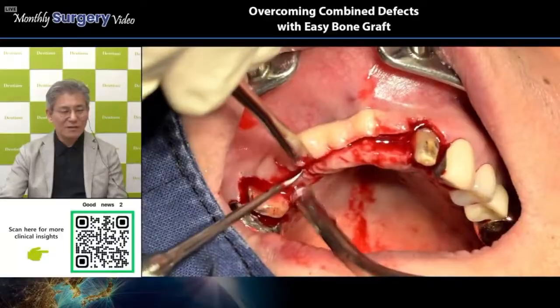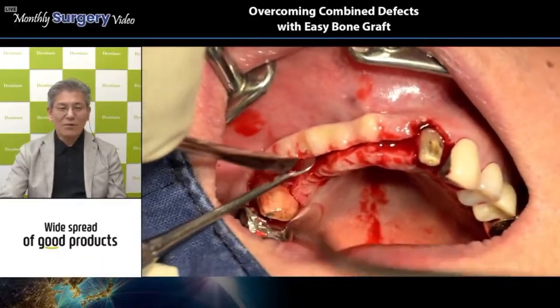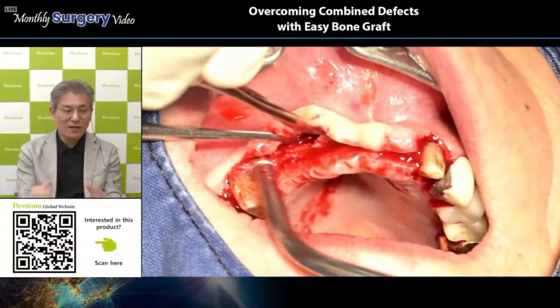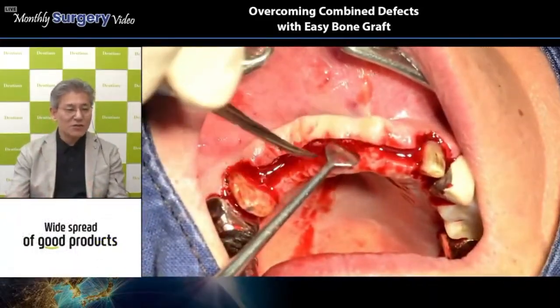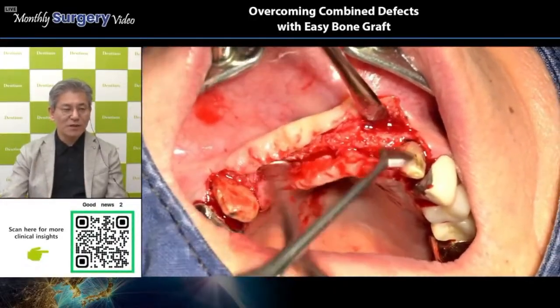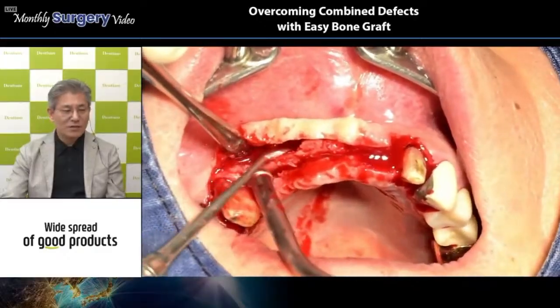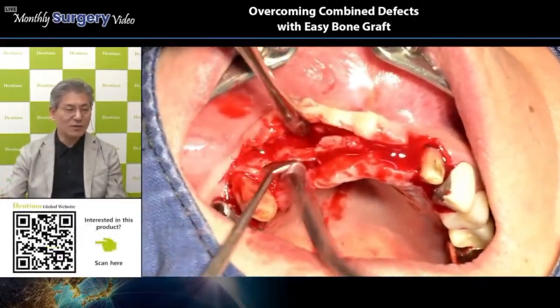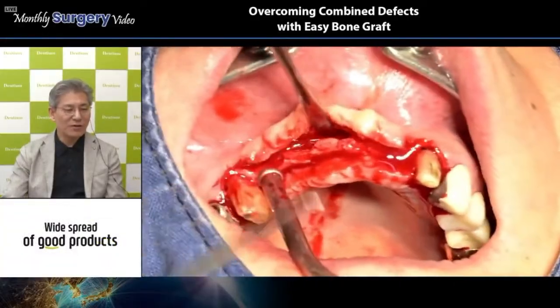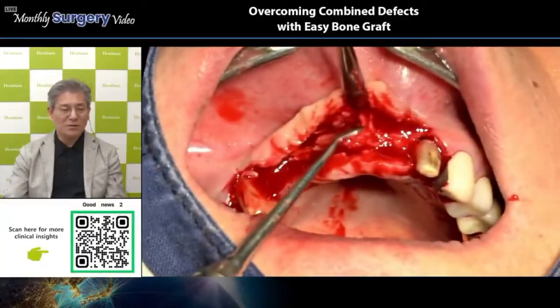So, what about this area? The number 21 site is actually a very thin narrow ridge, right? Even though the top portion looks a little wider, just underneath this area is extremely narrow, right? So it looks a little like a mushroom-style ridge shape. You always have to check the ridge shape. This ridge shape was already informed from the CT view. However, after flap reflection, you have to check manually with an instrument. And the number 11, 12, 13 area is also a very narrow ridge here. So this area is impossible to have an implantation.